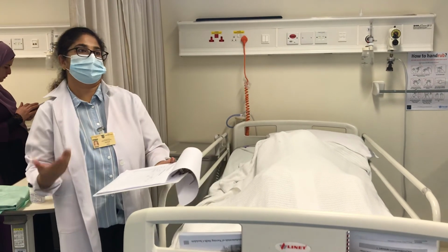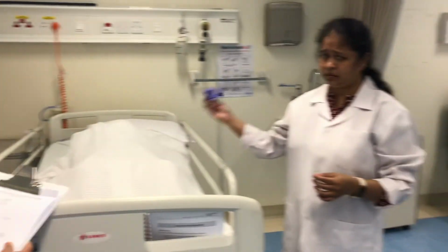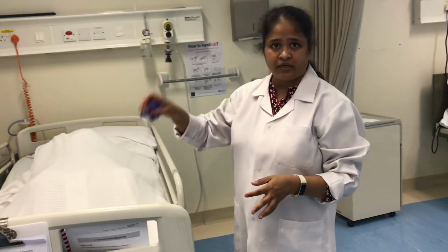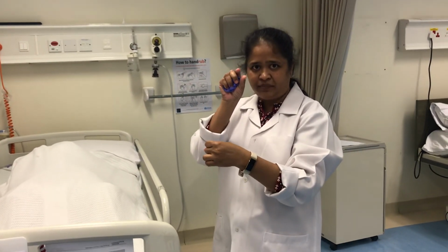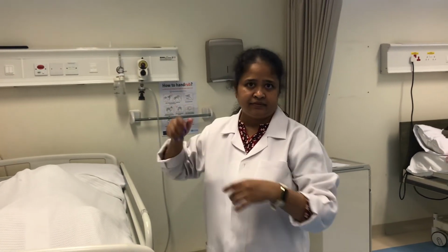Hourly or whichever is ordered. If you want, you can show your students how to remove it when you are finishing. So you teach them to wear gloves, put a syringe, remove the water which we put in the bulb first, and then just remove and discard the catheter. A sterile technique or just clean technique? Just clean technique.